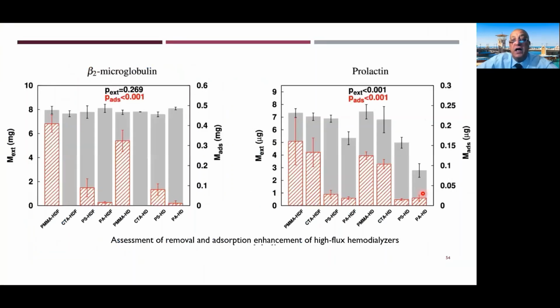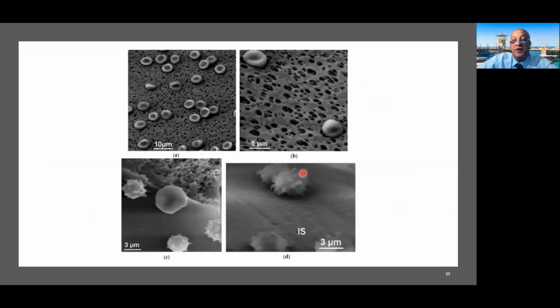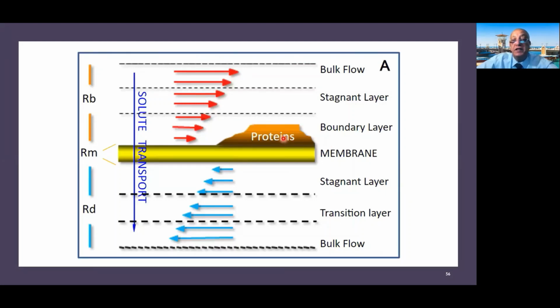So the removal by adsorption differs between dialysis membranes, while it is very high and increasing in hemodiafiltration compared to high flux dialysis, due to the increase in pressure and transmembrane pressure, increasing the protein adsorption, making filtration very difficult with adsorbed protein as well as blood cells. Moving these proteins away from the blood side makes the filtration return back to its starting level.